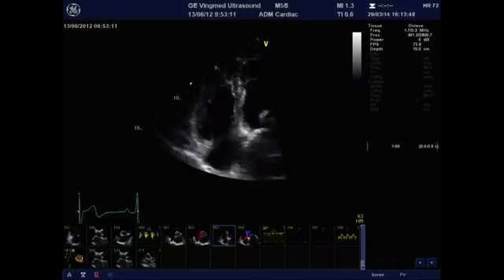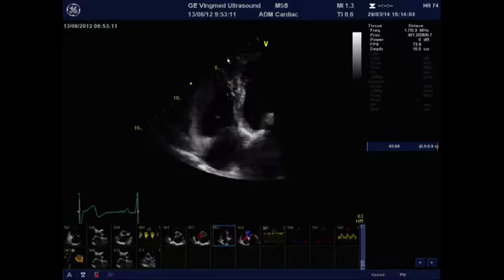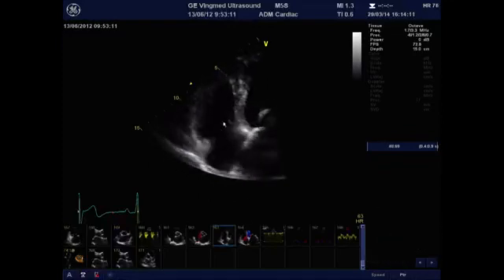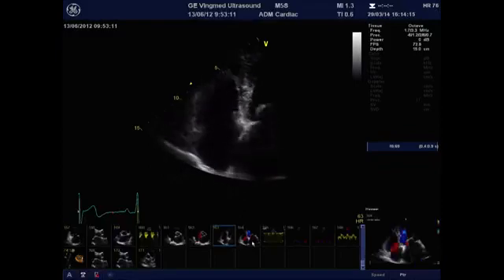And you can see here from this patient that there is a not so important dilation of the right ventricle, because the basal diameter is 3.7 centimeters, but what you can see if I take my measurement off, is actually that this patient seems to have some kind of hypertrophy of the right ventricle. So this is an indirect finding that suggests that this patient has probably pulmonary hypertension.